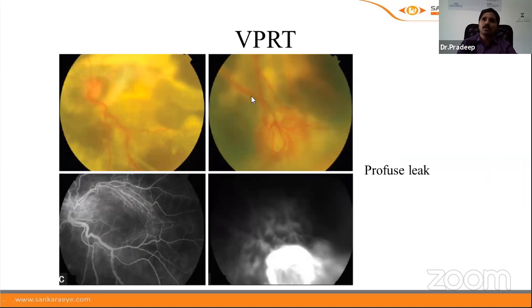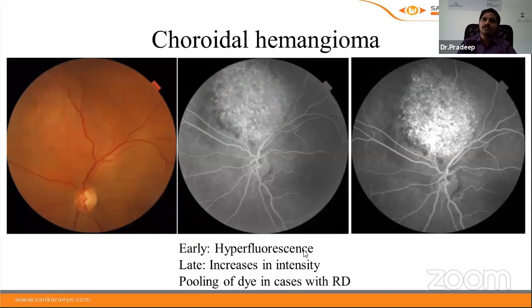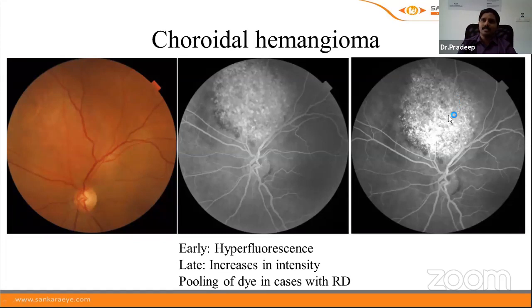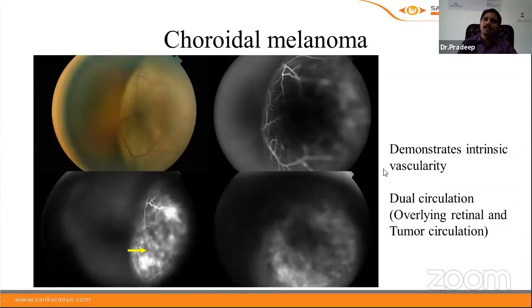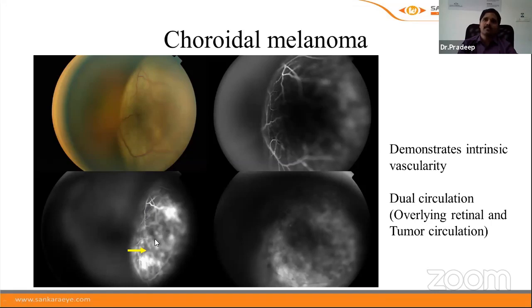Vasoproliferative tumor of the retina appears as a yellowish-white vascular lesion with profuse leak on FFA. Choroidal hemangioma shows early-phase hyperfluorescence with late-phase staining and pooling if neurosensory detachment is present. Choroidal melanoma demonstrates a dual circulation on FFA — both the overlying retinal vessel circulation and intrinsic tumor vasculature are visible. FFA is essential in suspected melanoma to differentiate it from other choroidal tumors.